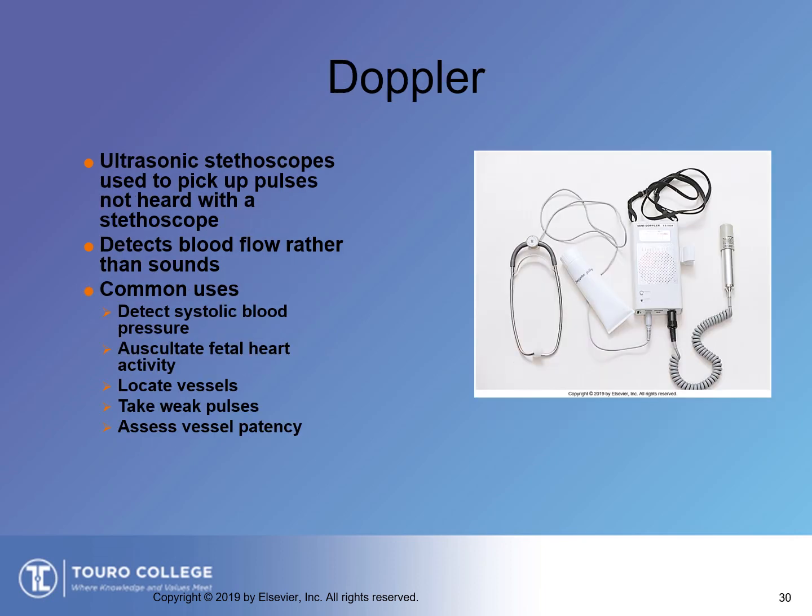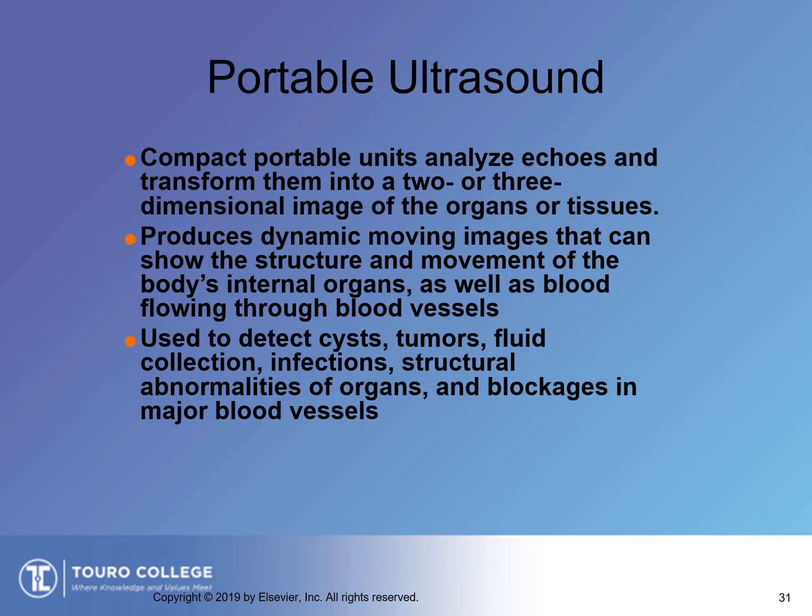Doppler, I don't use these, but a lot of places do. Ultrasonic stethoscopes, they use them a lot to detect blood flow and pulses. If a patient has pulses in their feet, if they're experiencing, oh gosh, I wanted to say retinopathy. What am I talking about? You know, where they can't feel their feet, neuropathy. A portable ultrasound, again, this is not something that I use. You'll see this in some clinics. Some offices actually have portable ultrasounds as well, but a lot of ultrasounds in the emergency department.